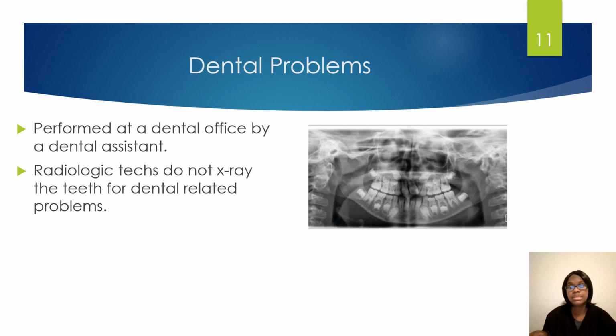And then you also have dental problems. Now, as radiologic technologists, we do not x-ray teeth for dental related reasons. This would have to be done in a dentist's office, maybe with a dental assistant. But if we do image the teeth, it's not related to any type of dental problems. It's related to something like the skull or maybe like a jaw injury or a nose injury, but it's never to check for cavities in radiology.